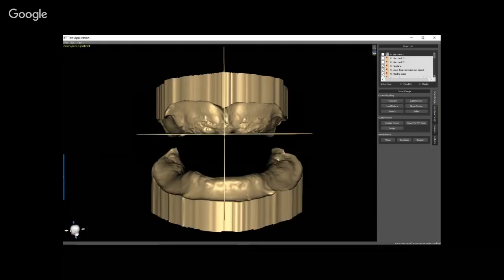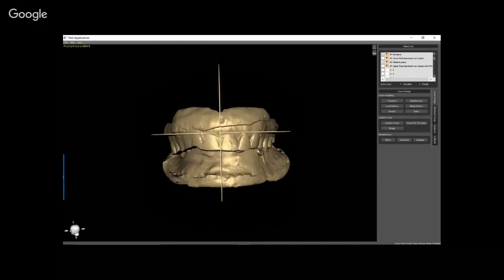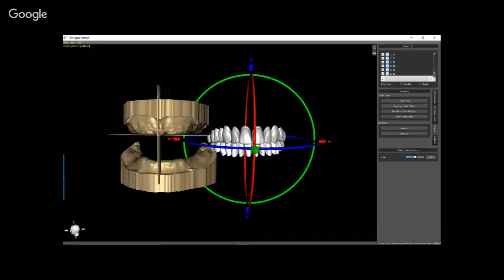I was just trying this to see if it would work and if I ended up with a good setup. Now, if I turn on his buccal bite of the previous dentures, it looks like I'm still dead on with the midline. The occlusal plane of his old dentures was a reverse smile line. It's kind of all over the place. So we're not using that as a reference at all.